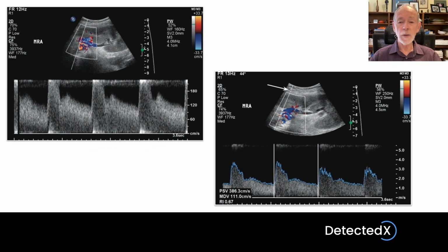Is this a problem? Not really. We're looking at extreme abnormal high velocities. That superficial sample volume, if it does happen to pick up significant Doppler signals, they're going to be very much lower in Doppler shift. They're not going to interfere in any way with our ability to see and measure the signal coming from the stenotic portion of the renal artery. So there is no practical problem with this, which is why this technique is commonly available.